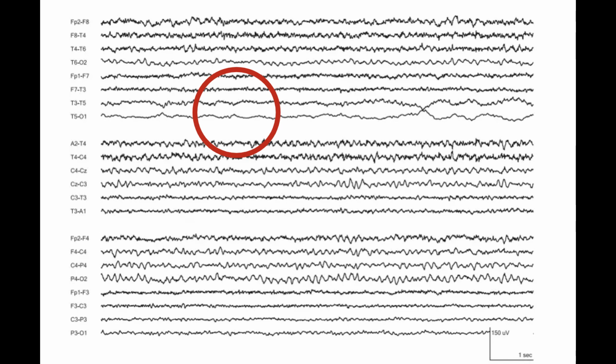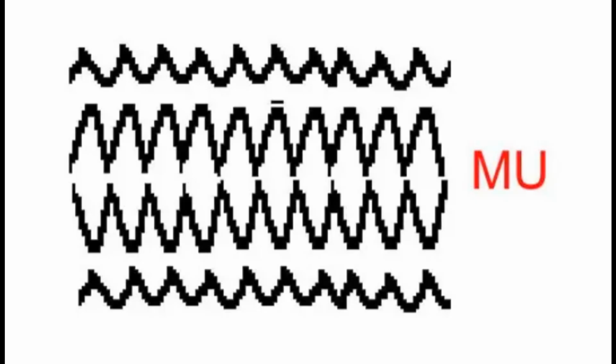So the side with the lower frequency is the problem. Yeah, that's the one. That's so counterintuitive. I know, right? I always thought it was a higher frequency. You would think. But the slower activity is like a disruption to that normal, faster alpha rhythm. So it's like an off-key instrument in an orchestra, throwing off the harmony. That makes sense.